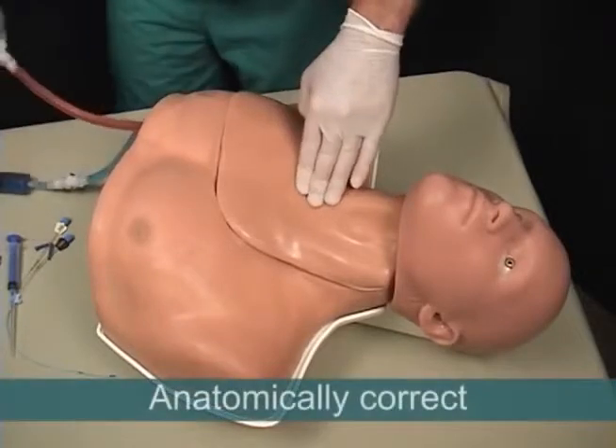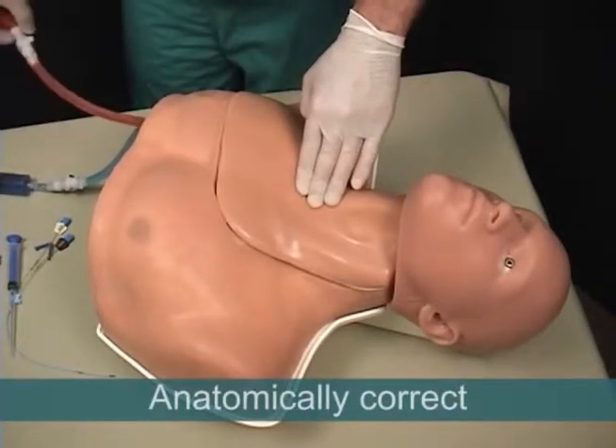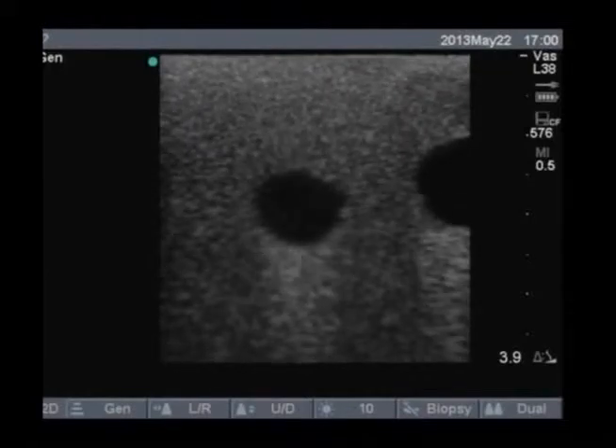The system is also anatomically correct, with landmarks that are both externally palpable and visible when viewed under ultrasound.